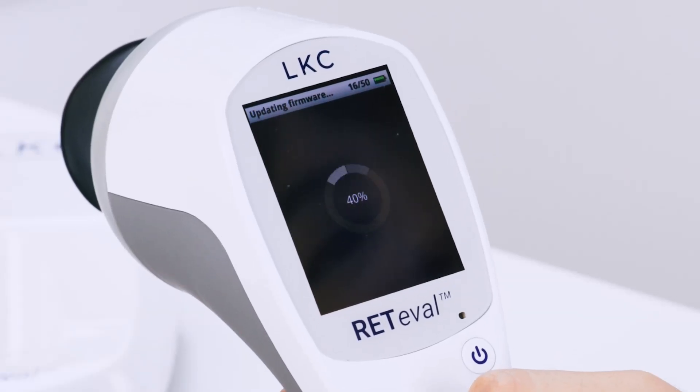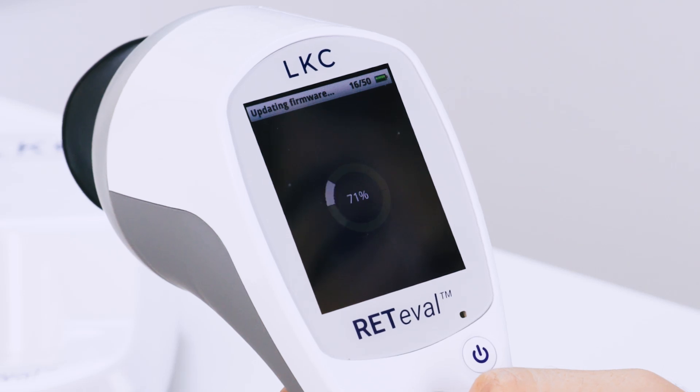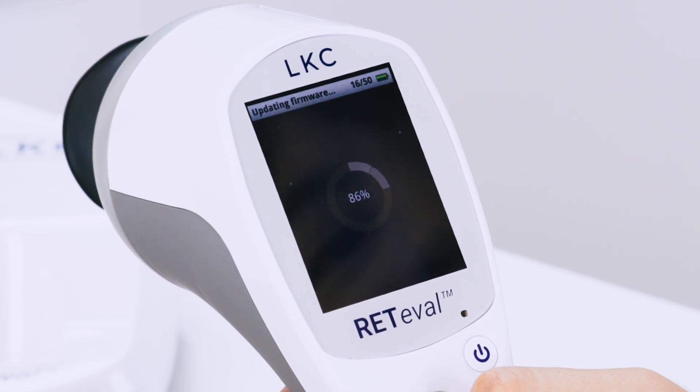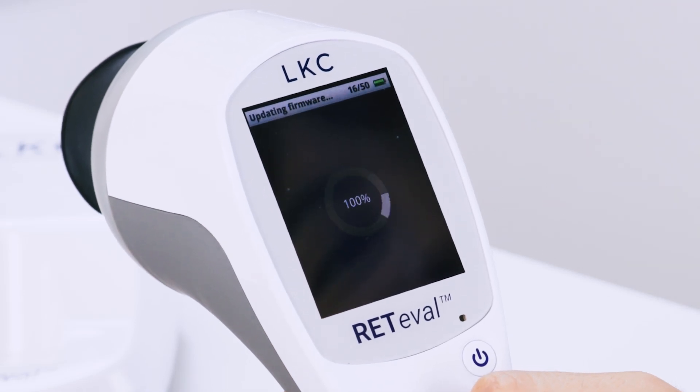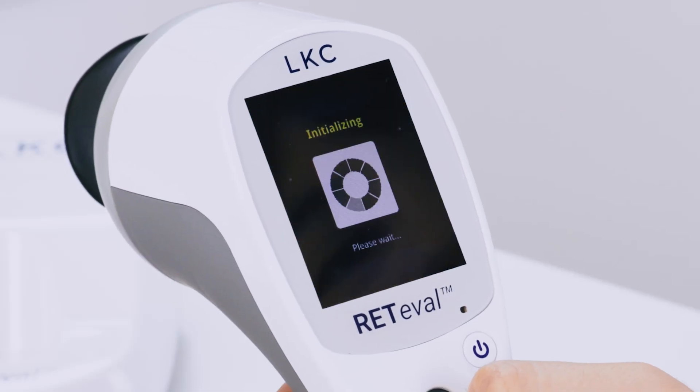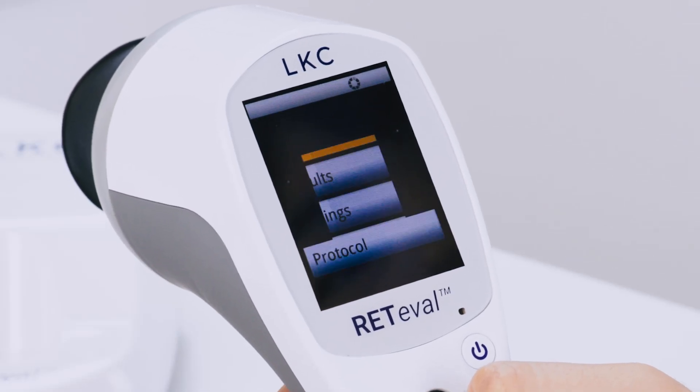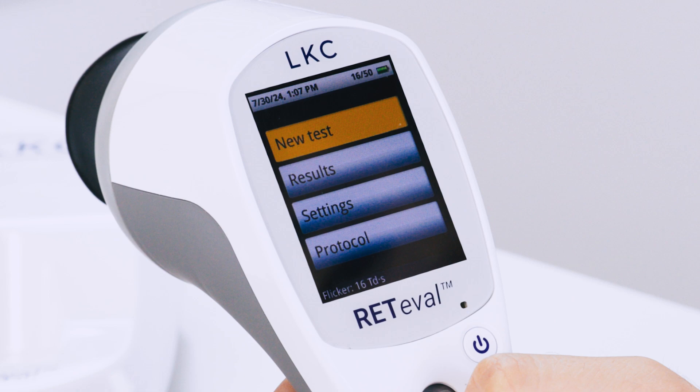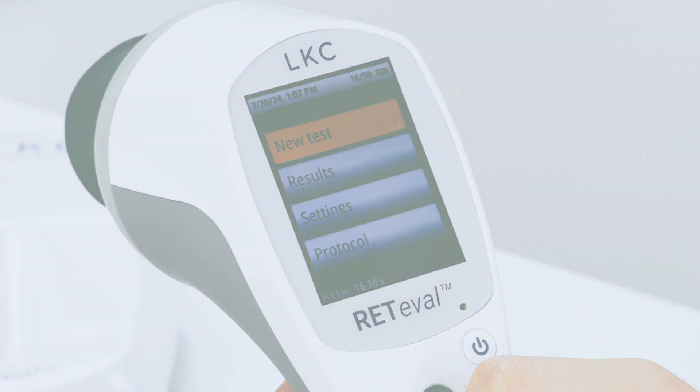You will see that your device is updating firmware at the top of the screen. After the update, the device will reboot and bring you back to the main menu. This indicates the update was successful.